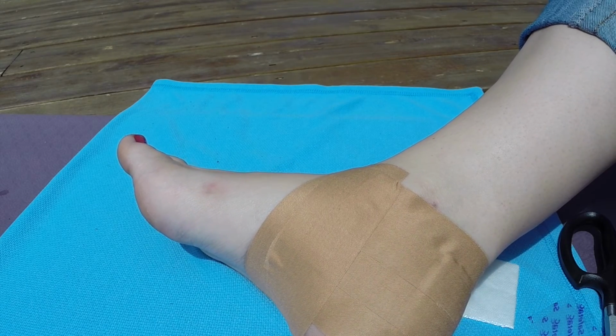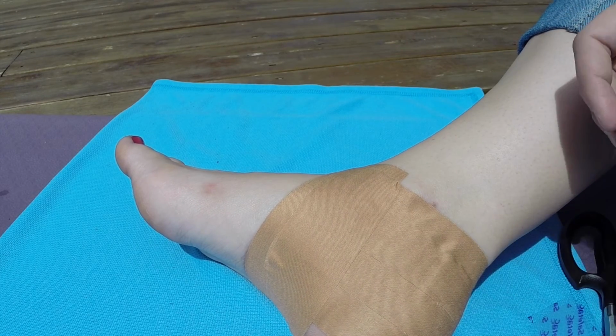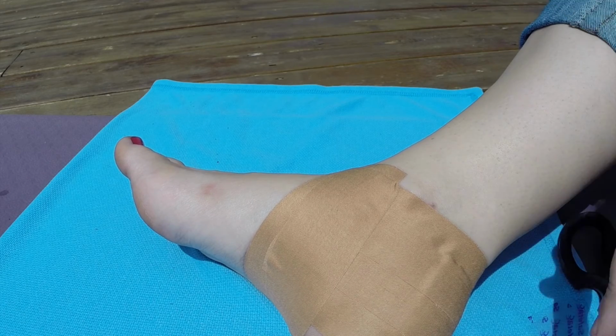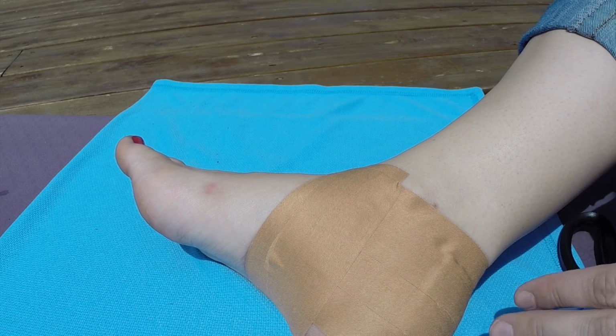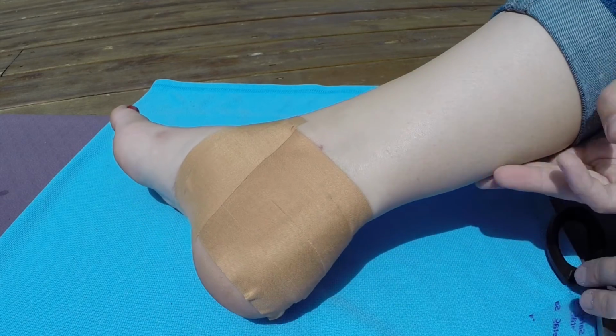So, key points to remember, you can definitely take the dressing off to evaluate the wound site. Things you might want to consider is to change the non-adherent absorbent dressing out. But remember, you can actually keep that piece of Mepital up to 14 days. So you leave that against the skin and just release the other layers.